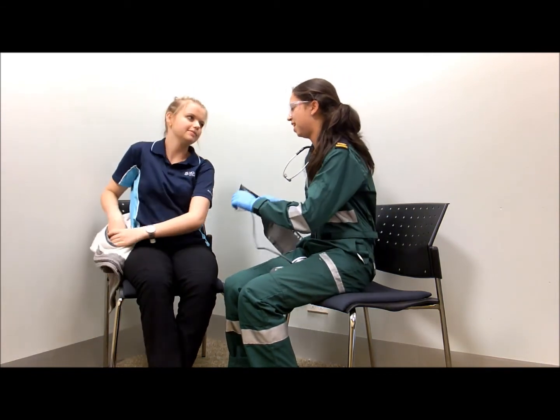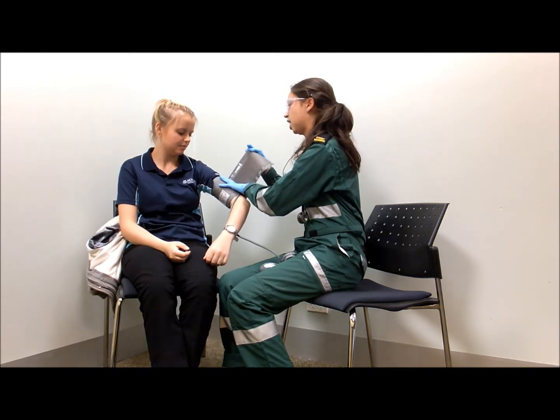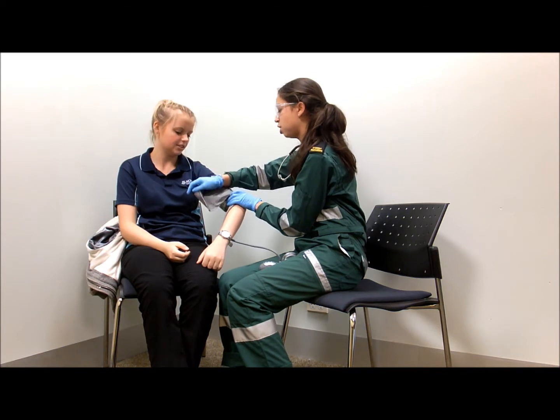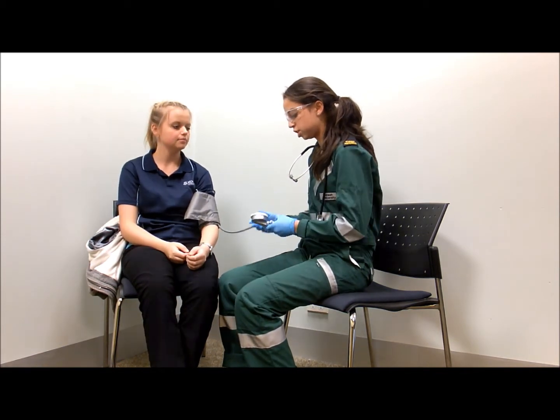Yeah. Quite a few times? Yeah, pretty old dear. Yeah, that's fine. So you know that it's just going to get a little bit tight and uncomfortable. Just let me know if you feel uncomfortable, and I'll just stop. Yeah. Thank you. Okay, so now I'm just going to feel for Mrs. Jones's radial pulse.